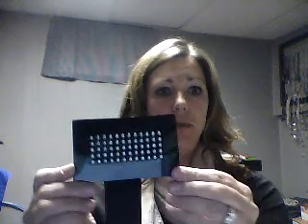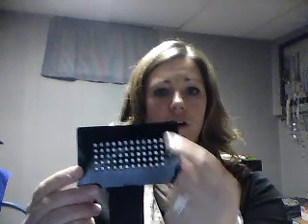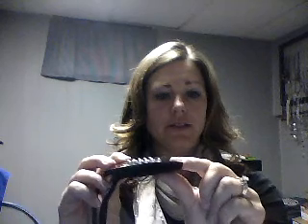So the equipment, and there are two typical pieces of equipment. There is the clinic system, which is much larger. It's a bigger box, and it has 8 electrode pads, and these are the pads here. You can see it has all the little diodes on here, and they're all little light bulbs. I'm going to turn it this way if you can see it. They are just little light bulbs, and even when they're on, they don't light up like a typical light bulb. It's an infrared light, kind of like the light on your remote control. You can't really see the beam, but that's what's happening here.